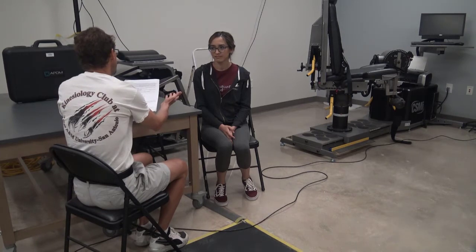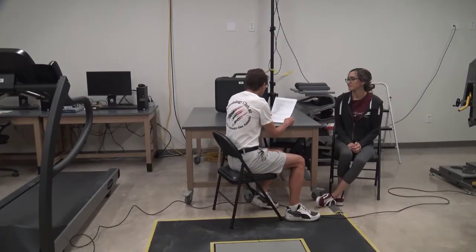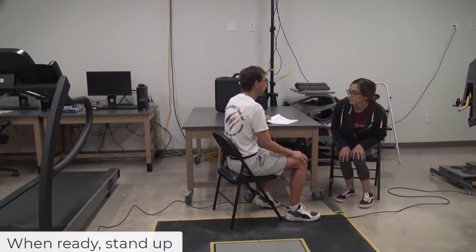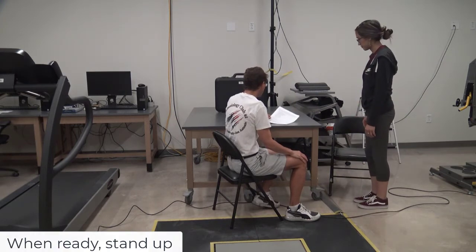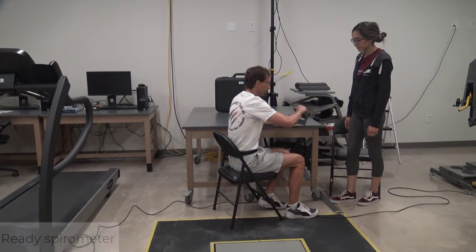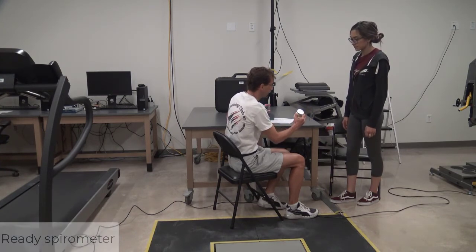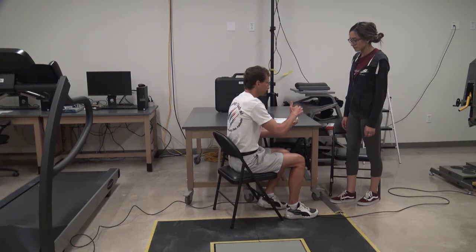So the first thing we want to do is ask our clients some questions about their prior activity, prior eating, anything that might interfere. Remember to have the client stand up. Ready the spirometer, show the client the breathing apparatus, and explain how to reset the dial.